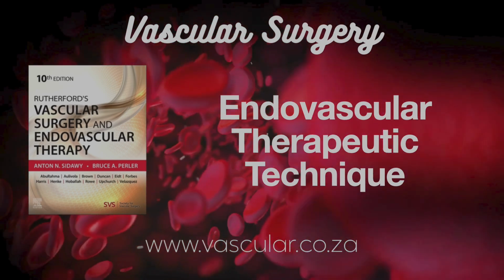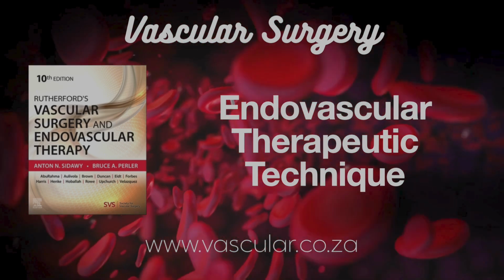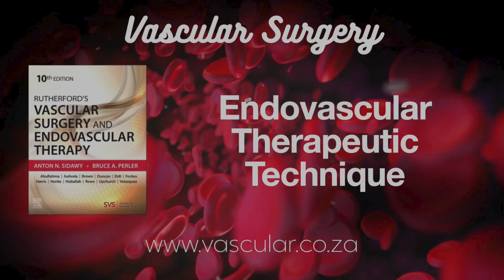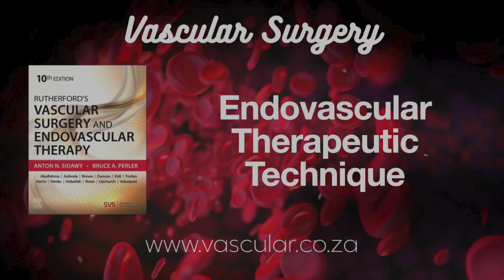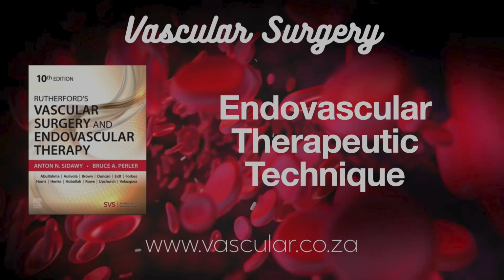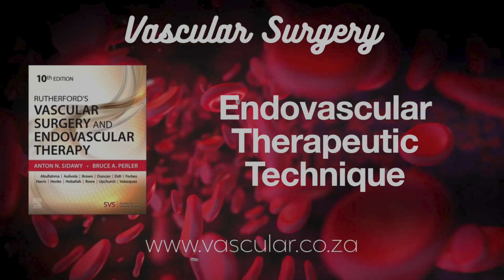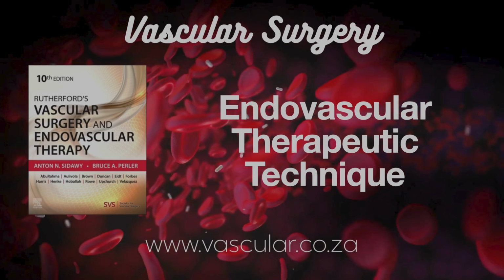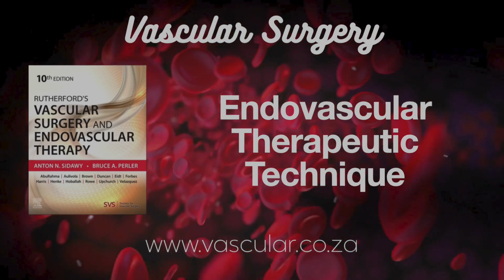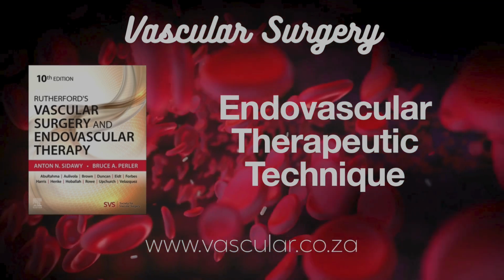So where are BES typically the preferred choice? Often for heavily calcified ostial lesions, those narrowings right at the origin where a vessel branches off a bigger one. Like renal or iliac arteries? Precisely. Renal, mesenteric, iliac, subclavian, brachiocephalic ostia. Their precise deployment and strong outward push work well there. But, as we said, generally avoided in compressible vessels like the internal carotid or the SFA in the thigh. Could get crushed. Okay, clear picture on BES.